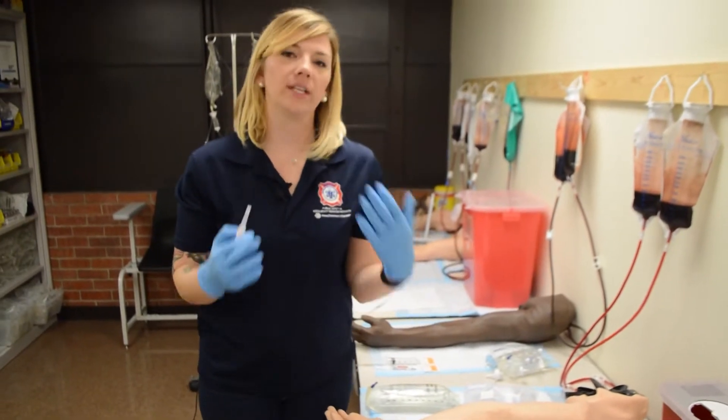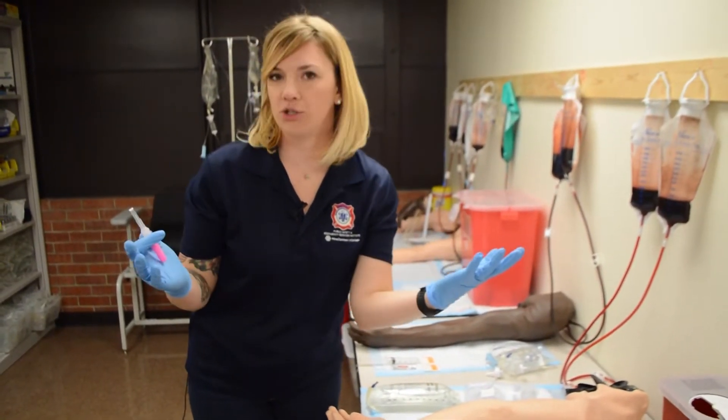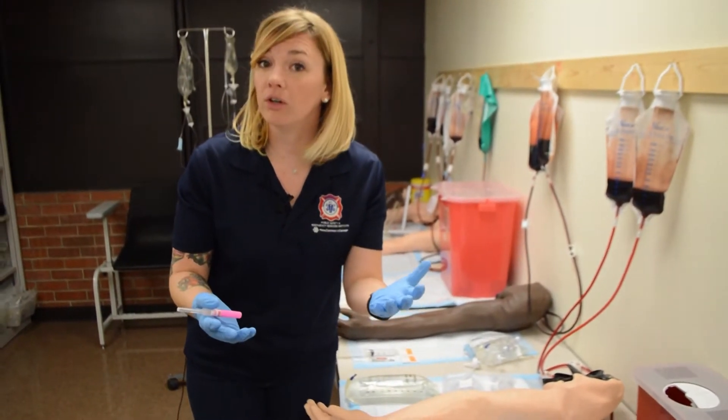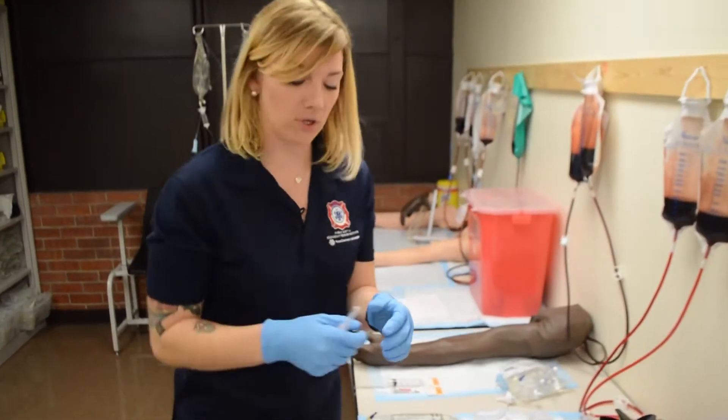Here's a tip. Let's say you get underneath the skin and you've lost your vein — we need to re-find it. Instead of digging around, or what we call fishing, I have a quick tip to show you how to redirect your needle without causing your patient a lot of pain.